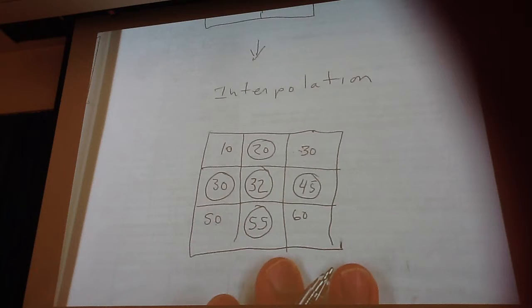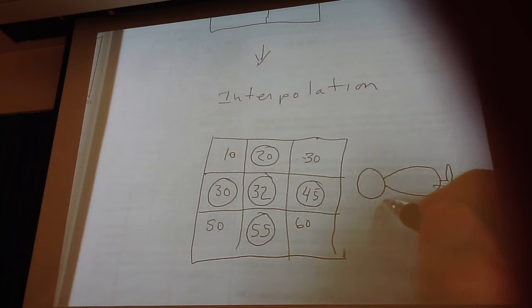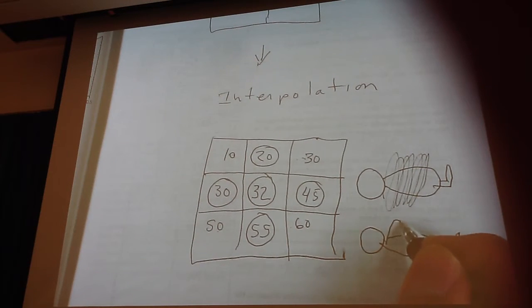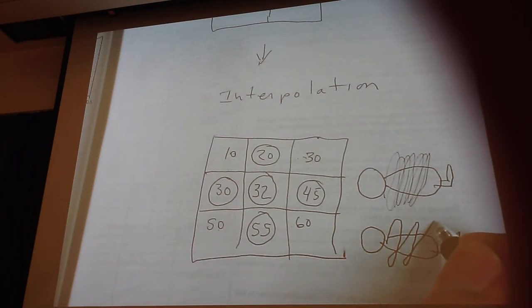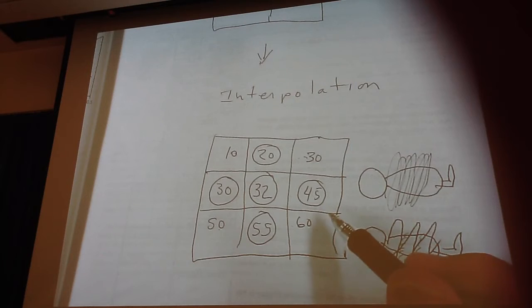Okay. Interpolation, we do this with CT scans a lot because if I'm doing a CT scan on a patient, if I scan every centimeter, the patient gets a really high radiation dose. But if I scan every other centimeter, it creates gaps of information here that I use the computer to interpolate and fill in.